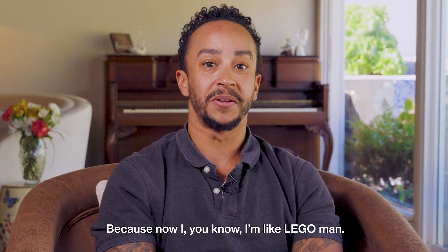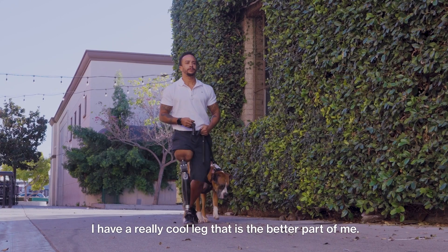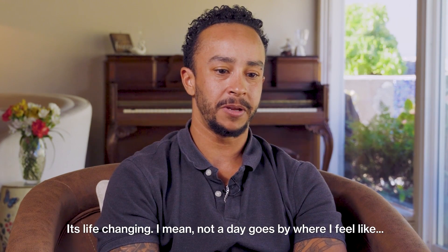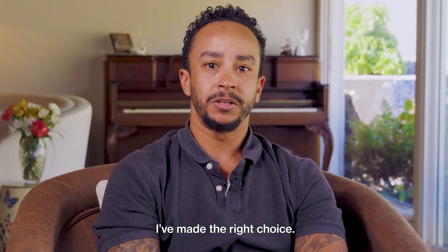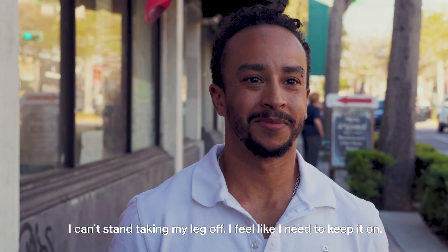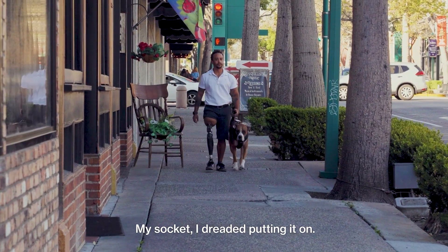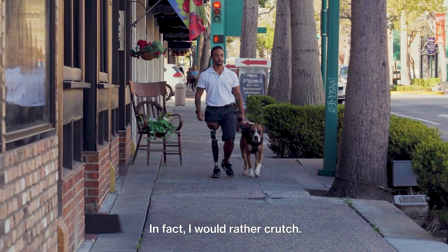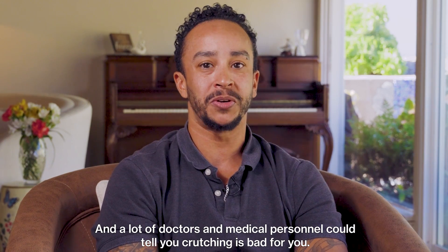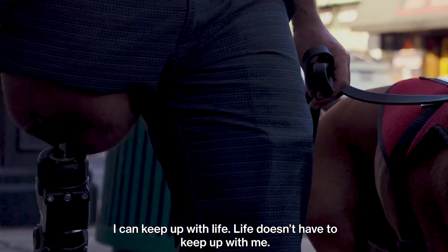I'm like Lego man — I have a really cool leg that is the better part of me. It keeps me going. It's life-changing. Not a day goes by where I don't feel like I've made the right choice. I can't stand taking my leg off — I feel like I need to keep it on. In my socket, I dreaded putting it on; I'd rather crutch, and doctors can tell you crutching is bad for you. Now I can keep up with life. Life doesn't have to keep up with me anymore.